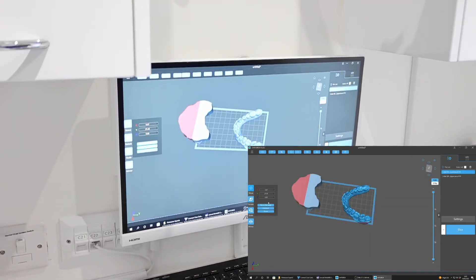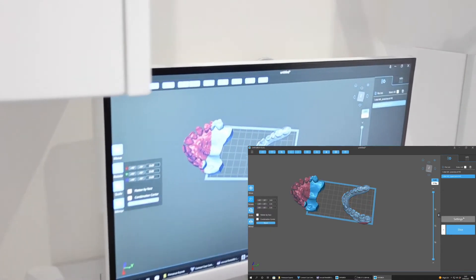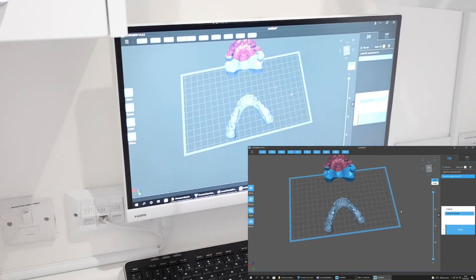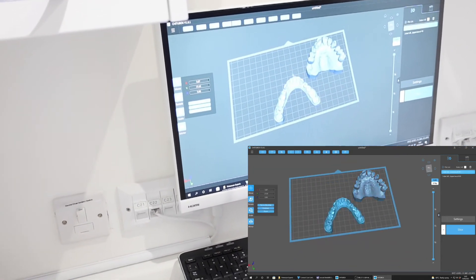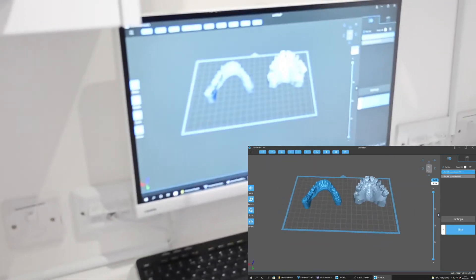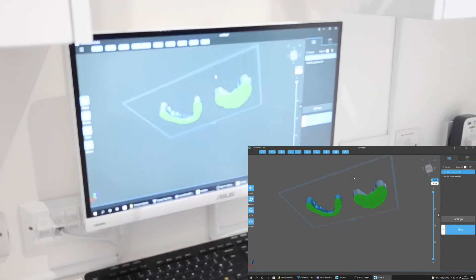It's on the wrong printer — that's okay, just change the printer quickly. The green indicates it's seating correctly on the actual build platform, and we're going to get those printed now.